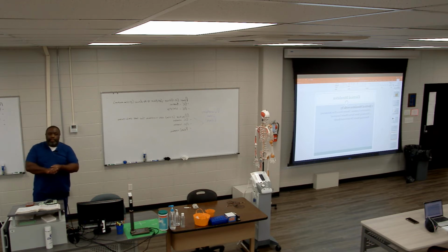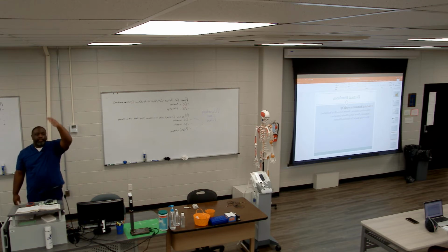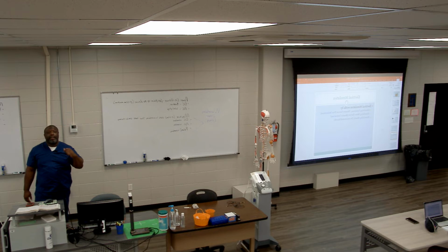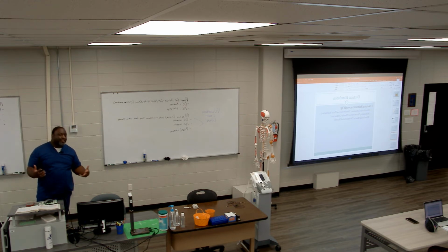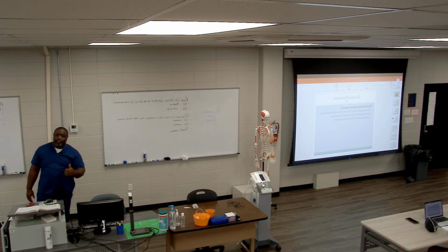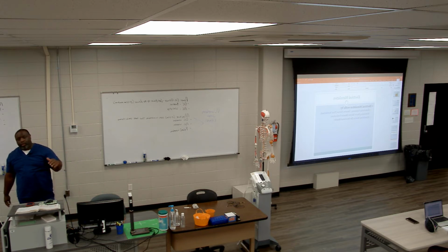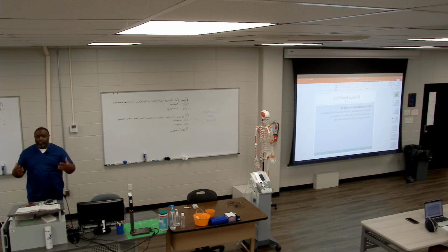So E-Stim can hack this system. Instead of my brain being the signaling agent that tells my nerve to signal my muscle that makes me move, E-Stim can signal my nerve, and then it tells my brain and my muscle to move. So I'm hacking the system. So I'm either stimulating cutaneous and sensory nerves to usually bring down pain, or I'm stimulating motor nerves so that I can facilitate muscle contraction.